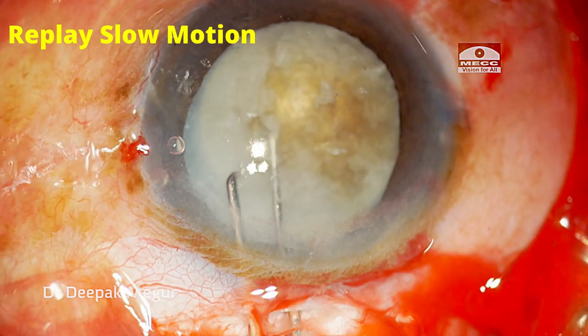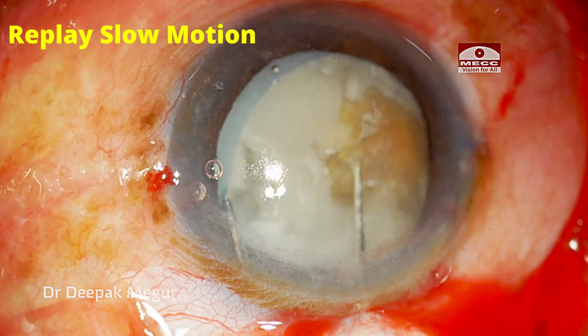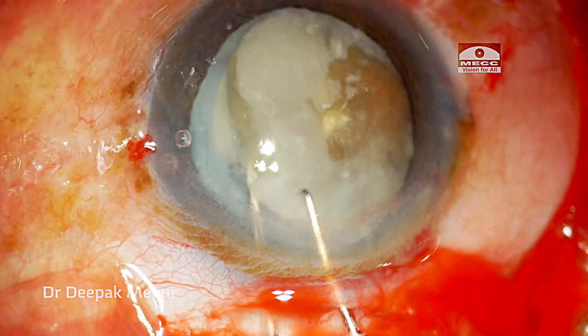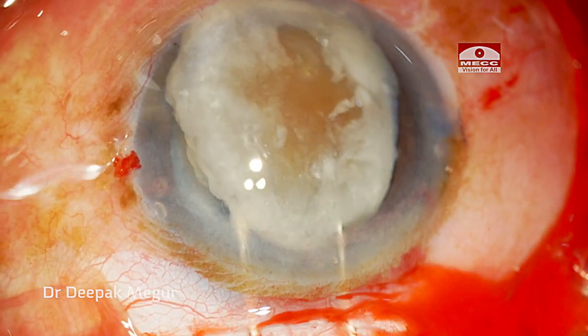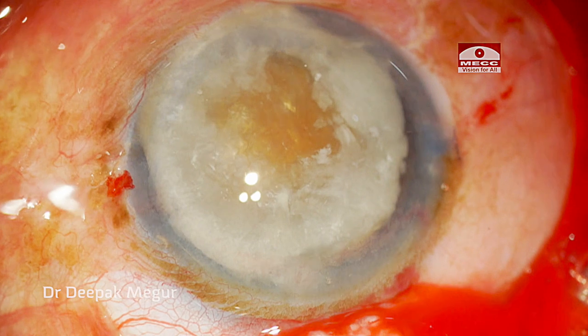Let's examine this in slow motion. One hook is gently pushing the nucleus down and the second one hooks the equator, and now both instruments are used to rotate or wheel the nucleus out of the bag.